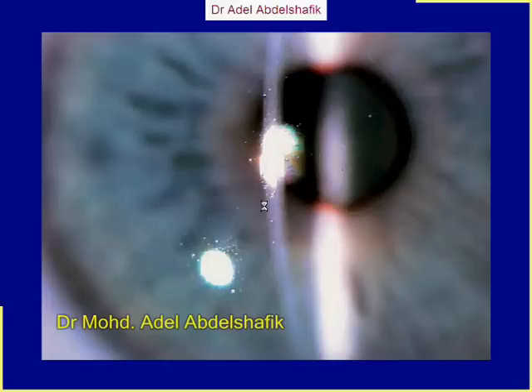What do you see here? We see dots all over. These dots most probably in the cornea. You cannot tell the level unless I make a section. So it can be in stroma, can be epithelial, can be endothelium.